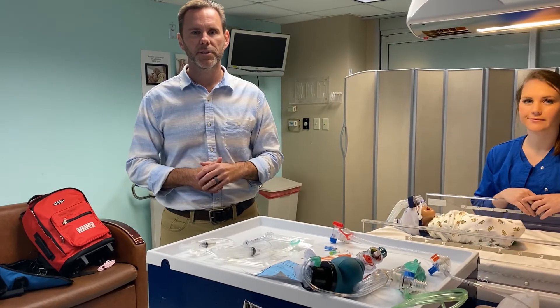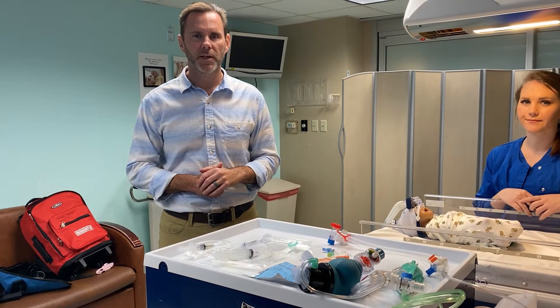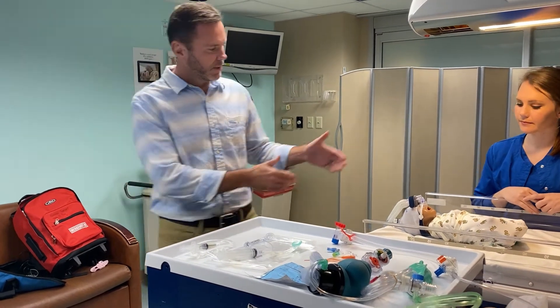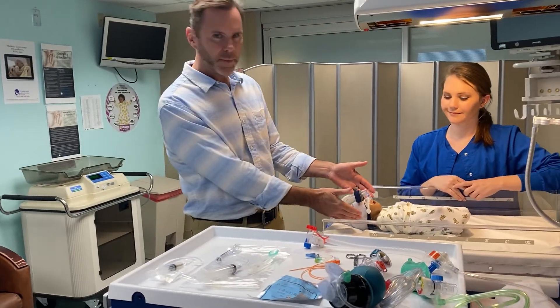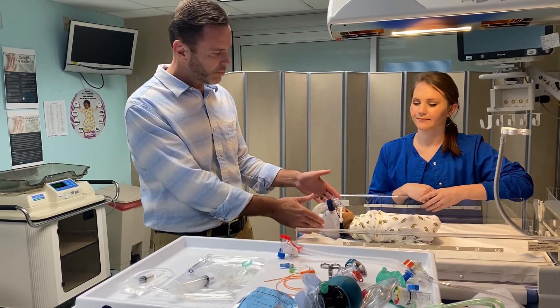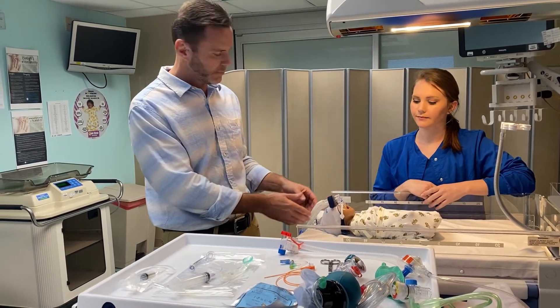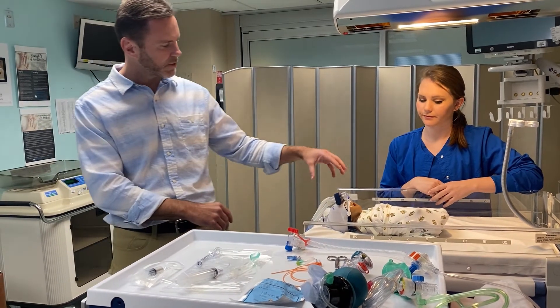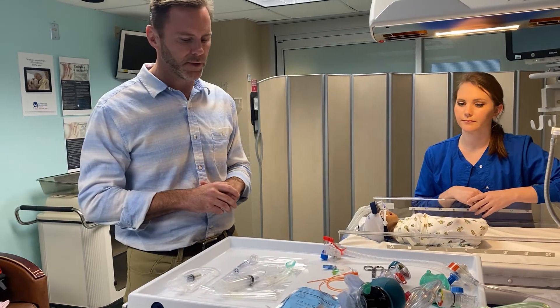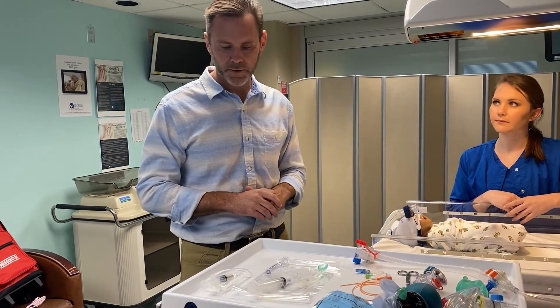I want to take a minute and teach you how to administer surfactant using the SALSA technique in a very simple way using some very simple equipment. We're going to imagine that we have our little baby here — he's got respiratory distress syndrome and is working hard to breathe. We've got him on CPAP, giving him the pressure he needs, stabilizing lung volumes, and we've determined at this point we need to give him surfactant.